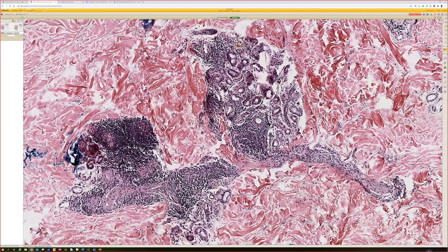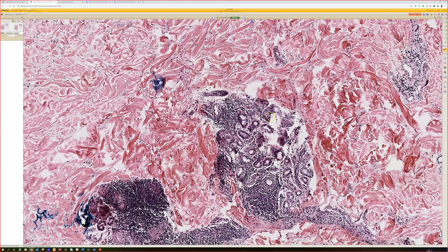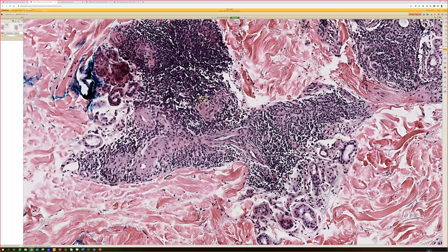I also see periecrine lymphocyte aggregates in pernio, which of course has a lot of overlapping features with lupus sometimes, and I've also seen it in bug bites — although you would expect a lot more inflammation up top and eosinophils. I often see periecrine lymphocyte aggregates, and I think this is a really hard case.